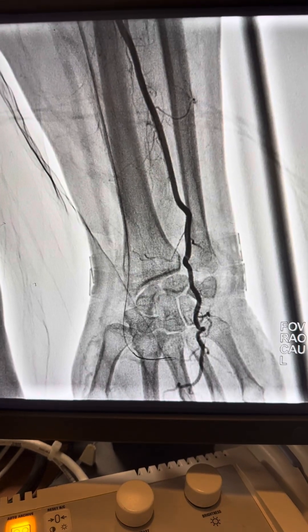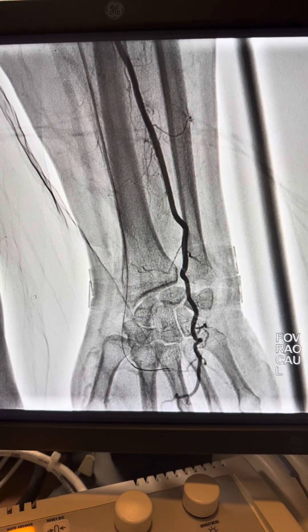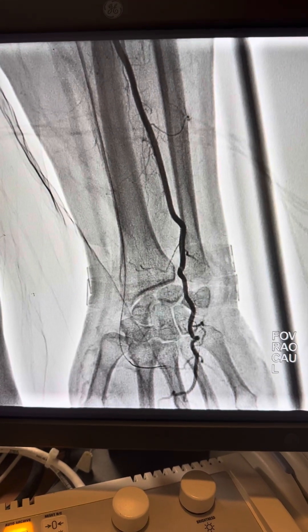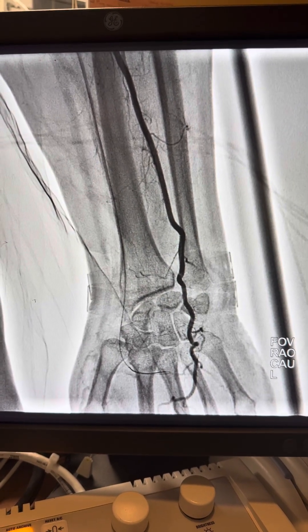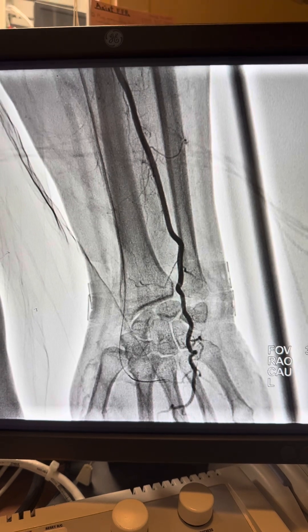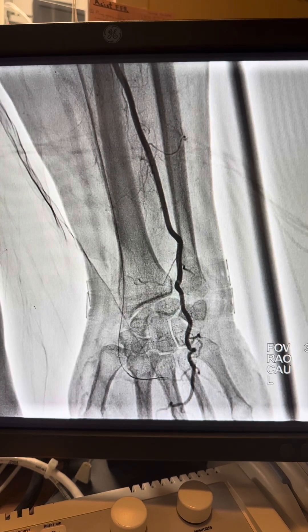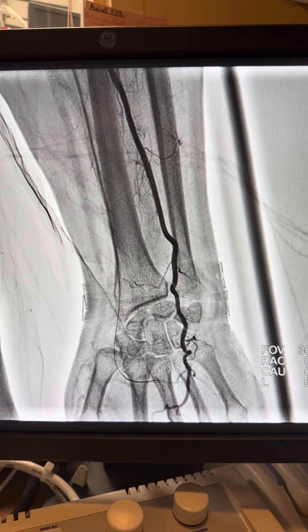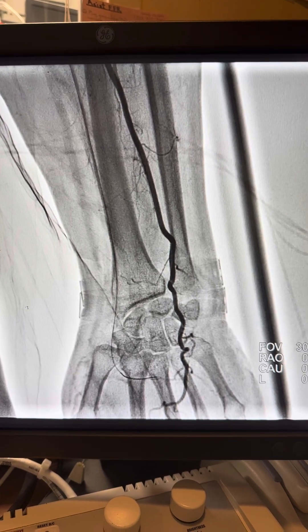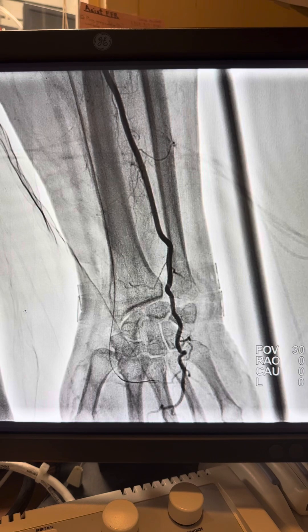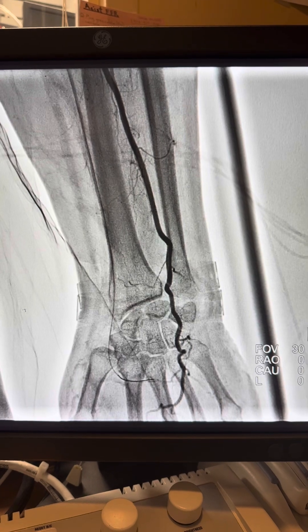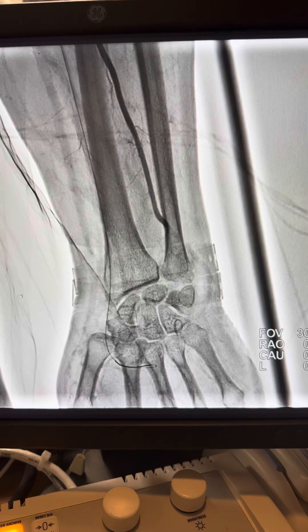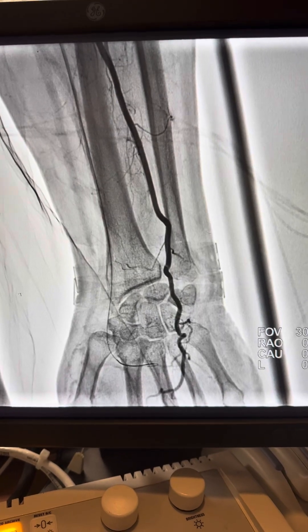Good morning. Today I'm going to discuss an interesting case of occluded left radial artery CTO — chronic occlusion, long-time symptomatic. You can see the ulnar is decent sized with nice flow, and given the collaterals, the flow is still sluggish.